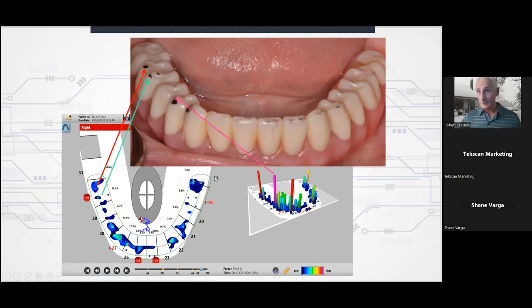And then using the 3D columns, you see how each contact maps to the location of the prosthesis compared to the T-scan data, the T-scan arch. And of course, this is the true challenge, seeing something like this and realizing, wow, that's very high force, whereas there's the same smudge and that's much lower force. So you can never tell the difference, even the dark ones, right? This dark one is very forceful on the premolar, and this dark one is a little less forceful, and this dark one is even less forceful, right? But it could be any of these. They all could be each other because ink doesn't tell you force.